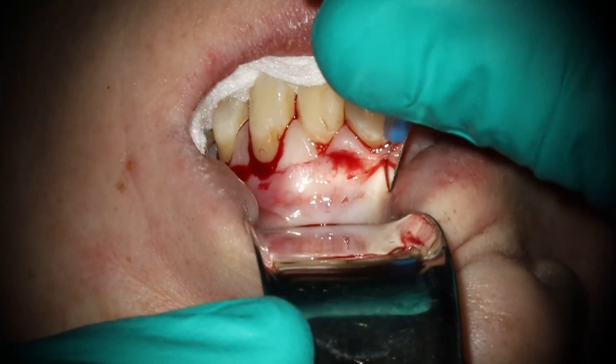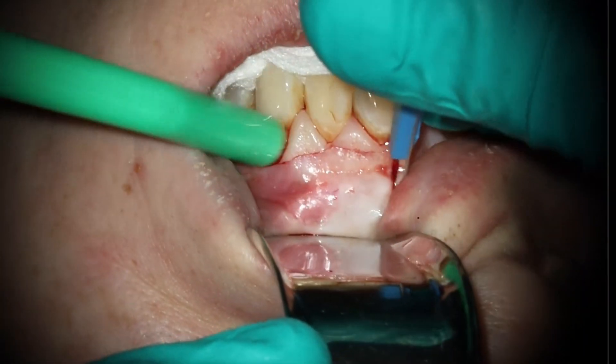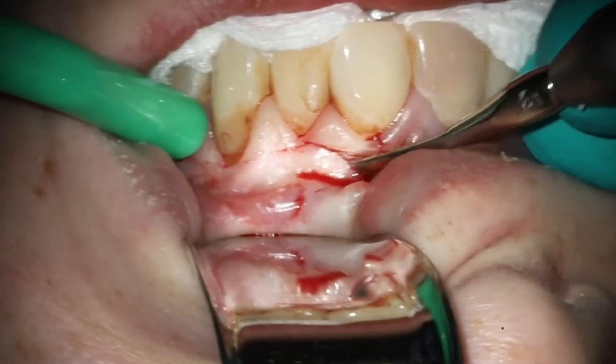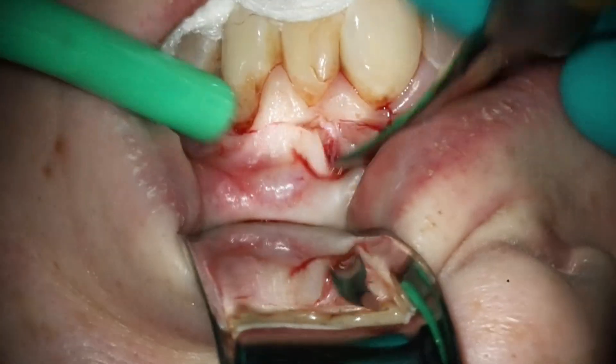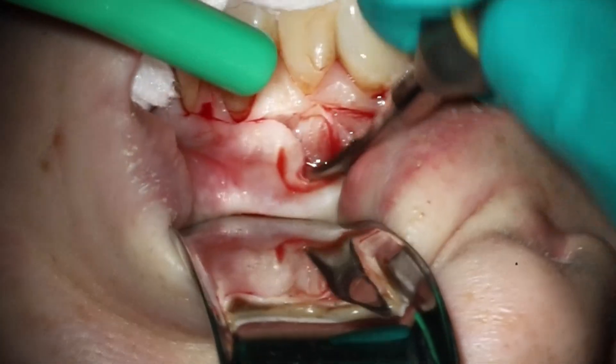Go ahead and do the vertical here. Ended up going right by the frenum. Her attachment wasn't too high so I didn't worry about doing a frenuloplasty or anything like that. Going down and starting to raise up the flap here with the periosteal elevator. As you can see, as soon as we uncover around that canine, there is no bone along the entire facial surface.